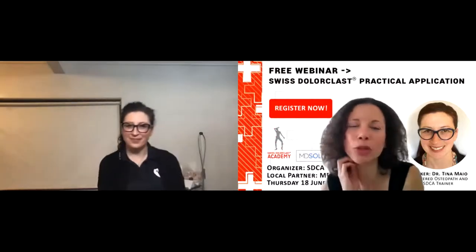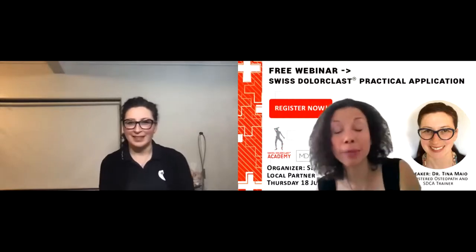A question we had concerning the penetration depth of the power end piece. How deep can the red handle penetrate into the tissue? So we know between 5 and 7 centimeters. Okay, perfect. Thank you. So it's more than the EVO. The EVO is between 2 and 4 generally. Okay.